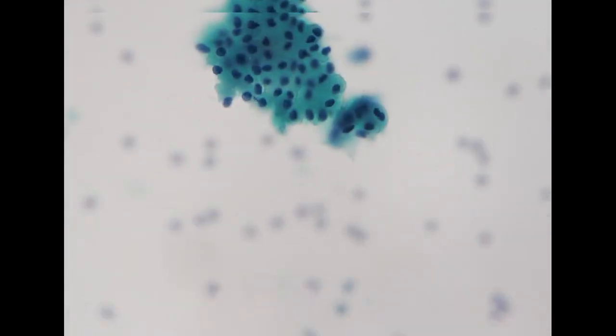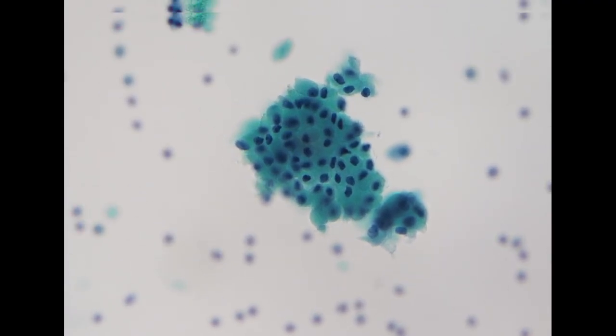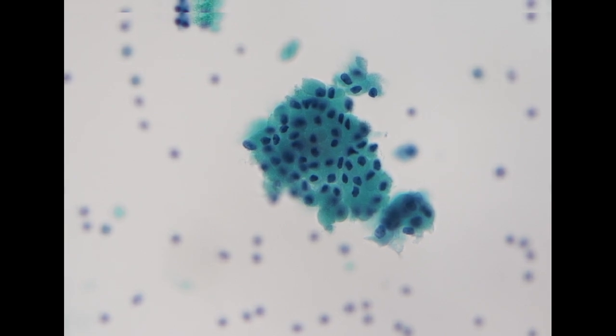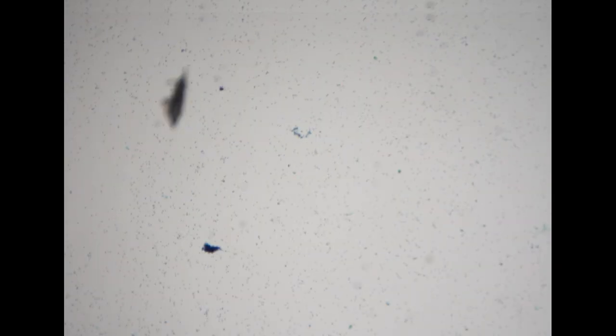So in this type of background, what we are looking for is flattened sheets of bland-looking oncocytic cells. So this is what we look for. This is a benign fragment of oncocytes with a very flattened arrangement. The cells are relatively uniform in size, and the arrangement is honeycombing. So based on the cytological features, we see benign large fragments of oncocytic cells in the background of lymphocytic cystic stroma. This combination equals Warthin tumor. So this is a Warthin tumor specimen.